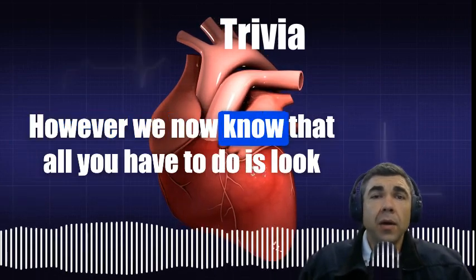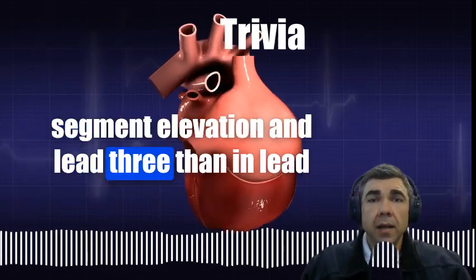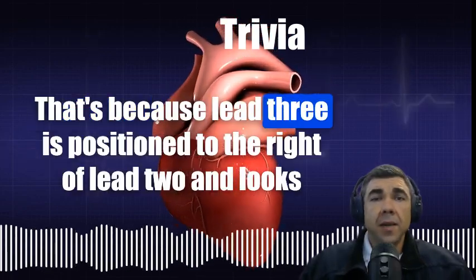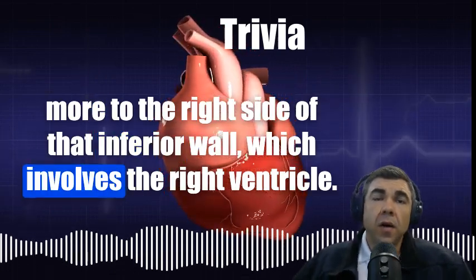However, we now know that all you have to do is look at lead 3 and lead 2, and if you have more ST segment elevation in lead 3 than in lead 2, it is almost certainly involving the right ventricle. That's because lead 3 is positioned to the right of lead 2 and looks more to the right side of that inferior wall, which involves the right ventricle.